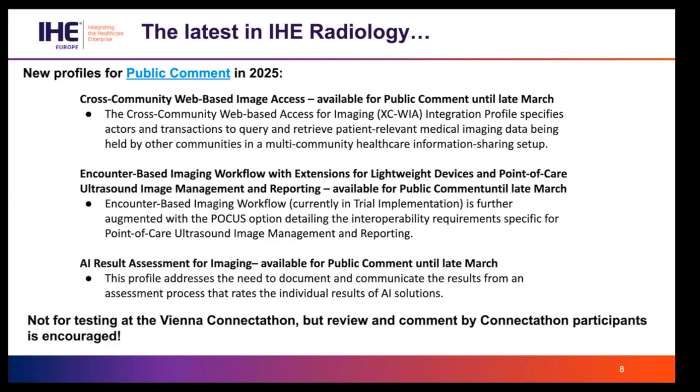And the last but not least is the profile which is going to come for public comment in the next week or so, the AI result assessment for imaging. Again, you could see that this is an AI-focused profile covering an area which has not been covered before, dealing with the assessment of results presented by particular models. Next slide.